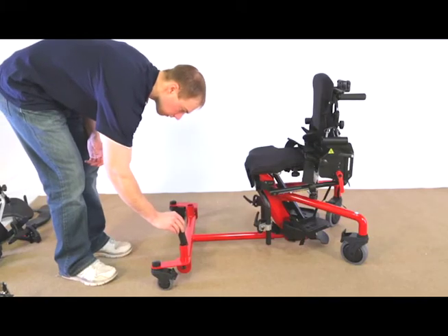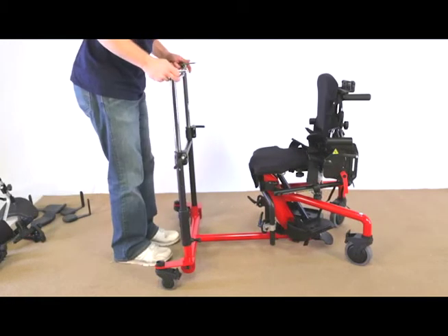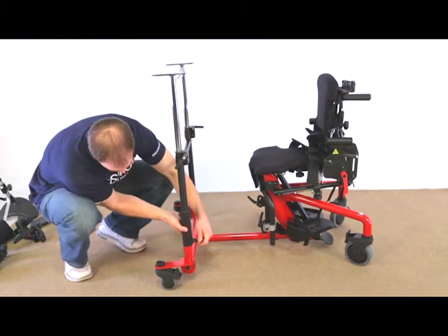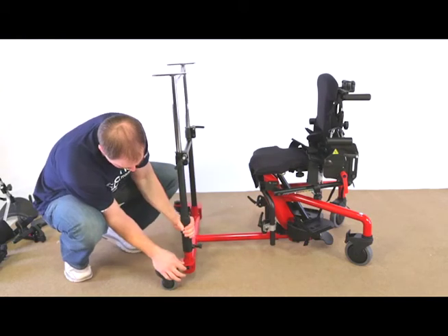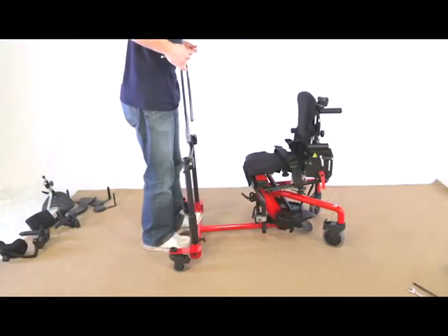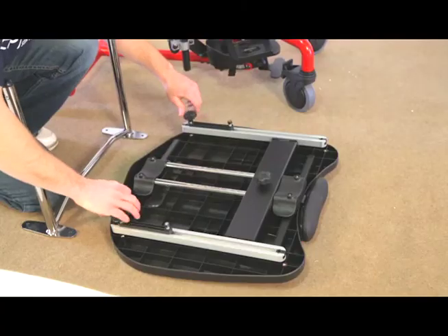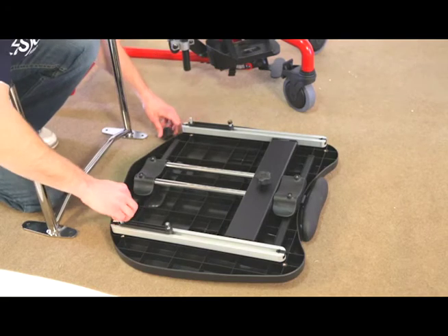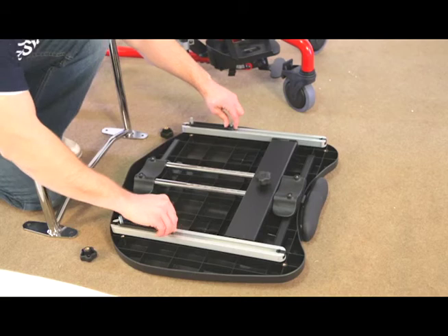If you ordered the optional swing-away front, make sure the swivel collar is placed onto the tube insert. Place the H-frame onto the base of the unit. Place the collar onto the frame until the plunger locks into place. Remove the tray bracket from the H-frame and set the bracket aside. Place the tray upside down. Remove the knob, nut, and washers from both tray slides and set aside.